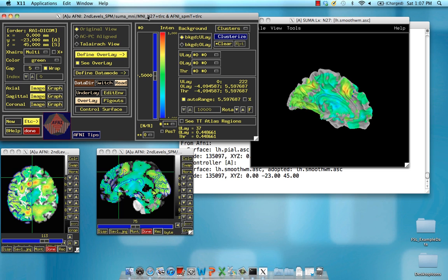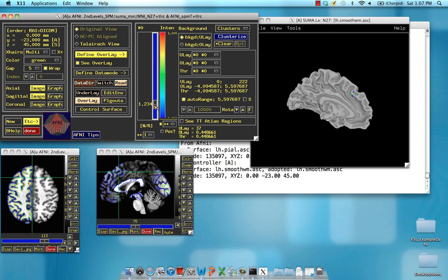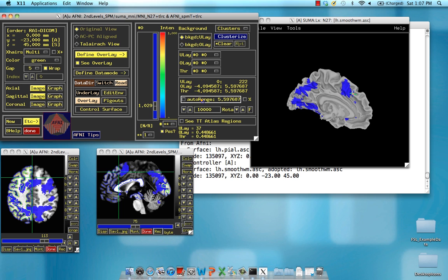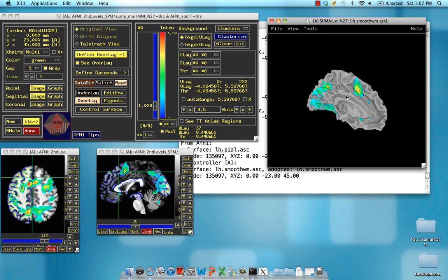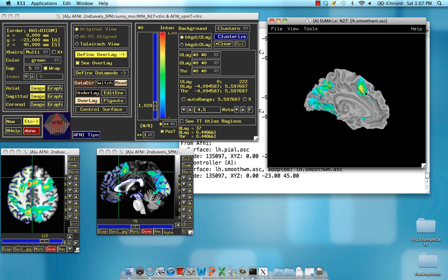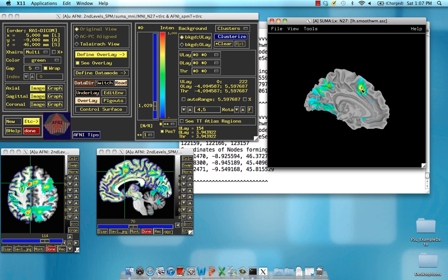I didn't output a cluster-corrected image through SPM — I could have, and that would have been a bit easier. But for now, let's just set this threshold — this T-value. It's somewhat arbitrary right now; I'll set it to 1 and only look at positives. I'll set the range to 4.5, representing the max intensity of the heat map. This is a T-map, so any values of 4.5 or higher will be coded with the maximum intensity, which is red.